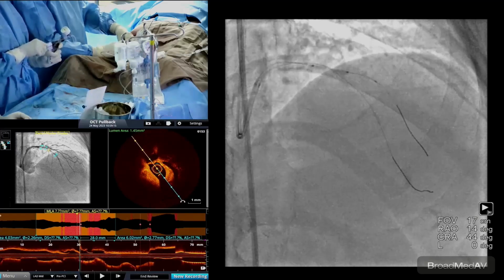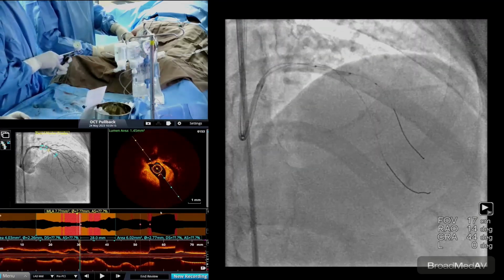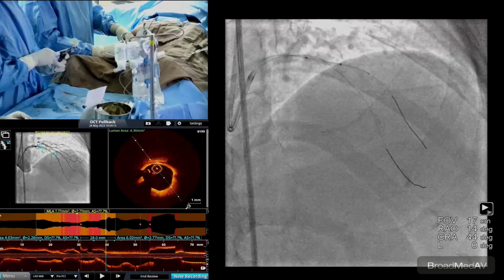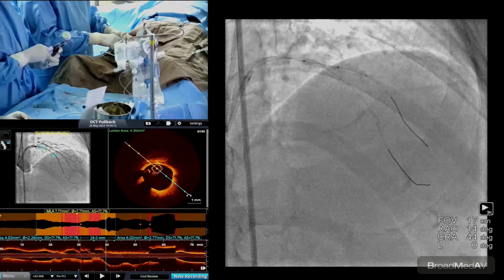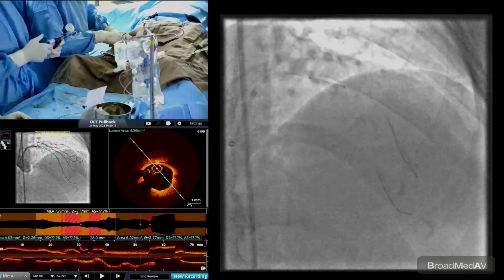So it's come up there in the diagonal. So that's opened up. Just a little longish dilatation so we don't have a closure of the diagonal. And then, as Dr. Nandakumar said, we'll put a 28, 2.5 stent, 28 ready please, Synergy or an Onyx. Yeah, deflate please.